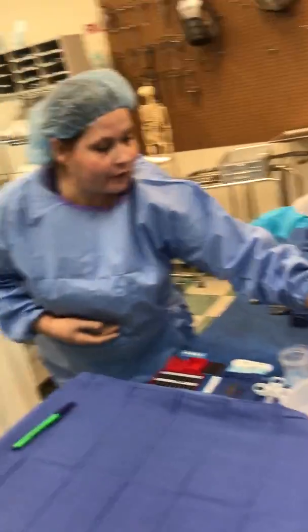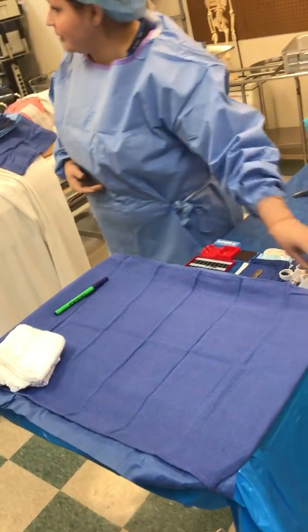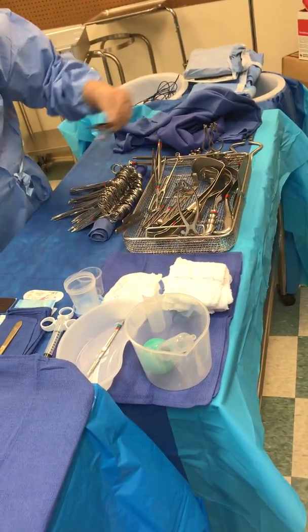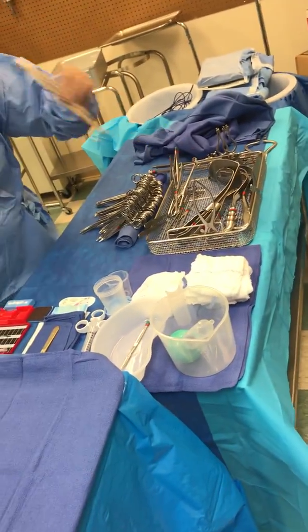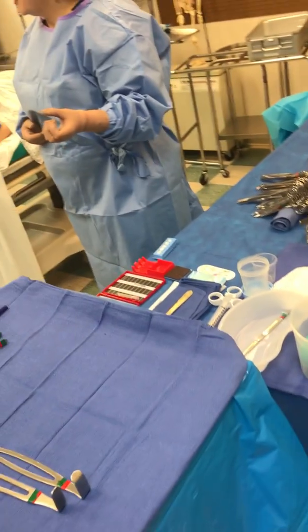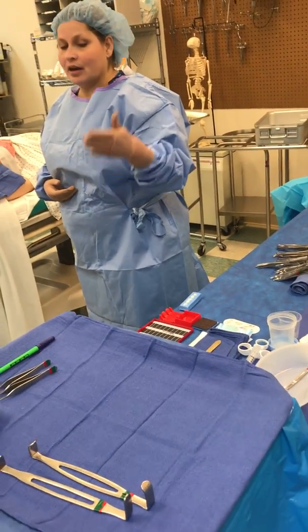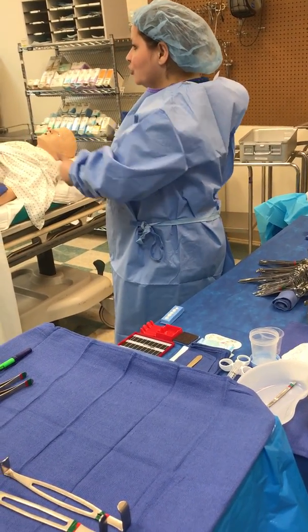You need to have the 2 laps up. He's gonna ask you for the blade. You're gonna need 2 hemostats. You're gonna need pickups. He's gonna wanna retract. Okay? The deeper he goes, he might wanna have cokers. Okay? Your basic start, you need to have that on top of your mayo. So that's why we need to anticipate, what is he gonna do?